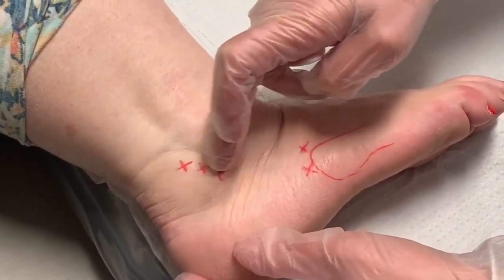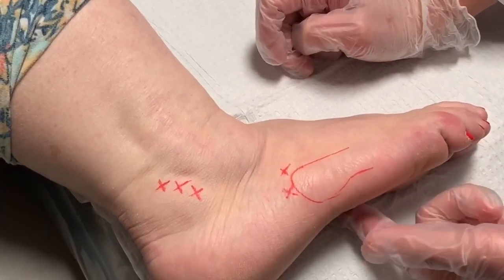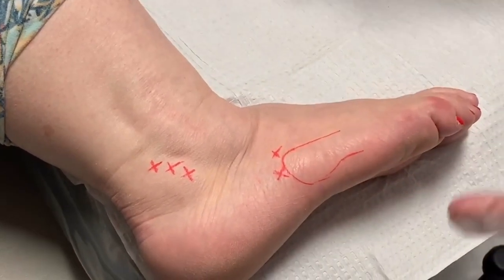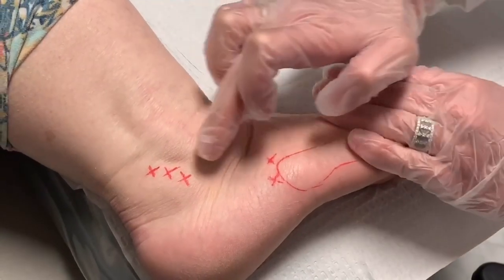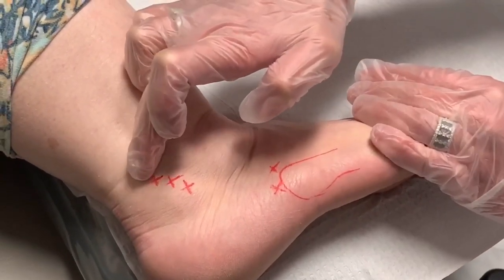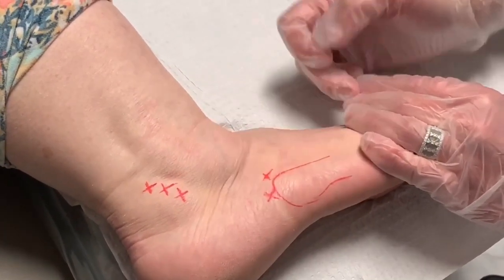The tendon goes this way — some of it attaches here, and some continues on to go to the bottom of the foot. This structure is very, very long and we use it every single step we take. I'm going to go from the top and flood all of this area, and then go this way and flood this area as well.